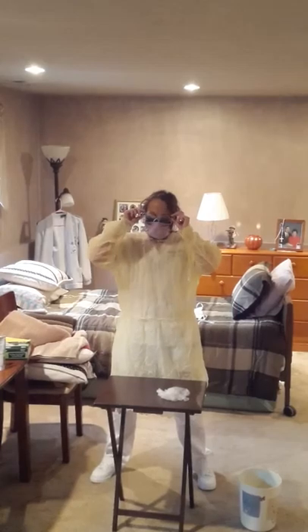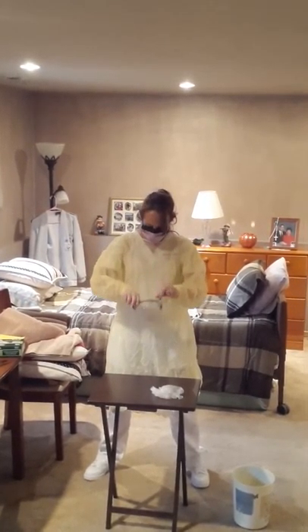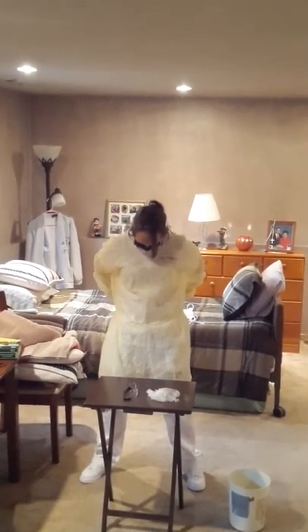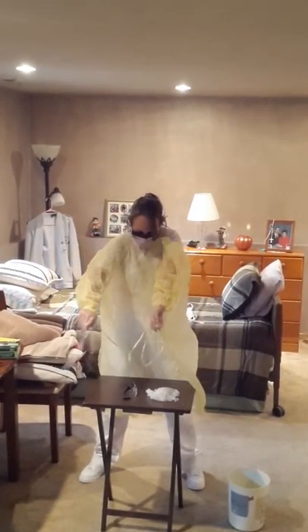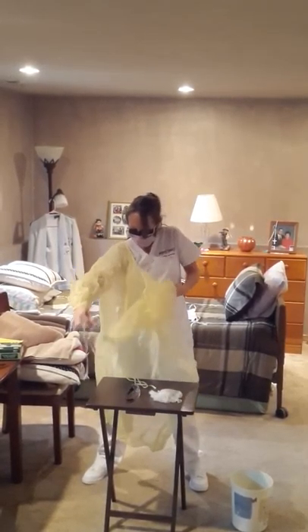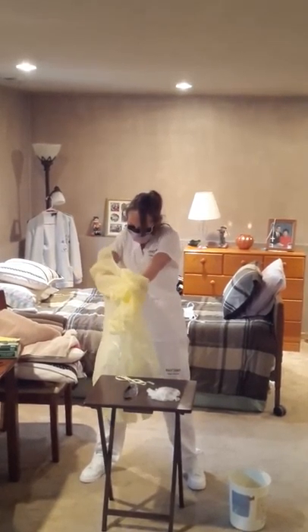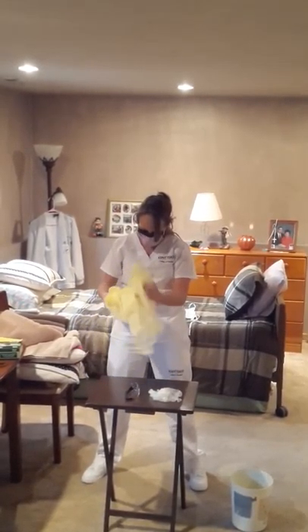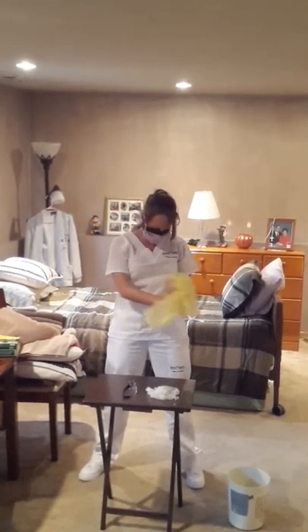Then you take off your goggles. Next, your gown — you can tear it away. You do not want to touch any of the contaminated area. Try not to shake it; ball it up and throw it away.